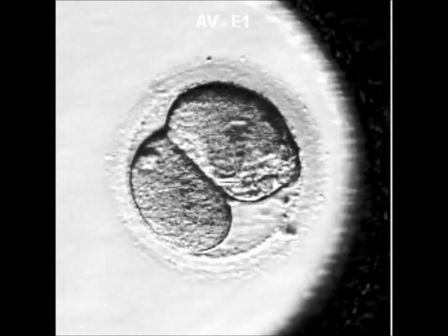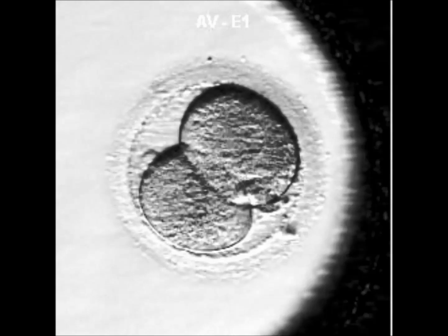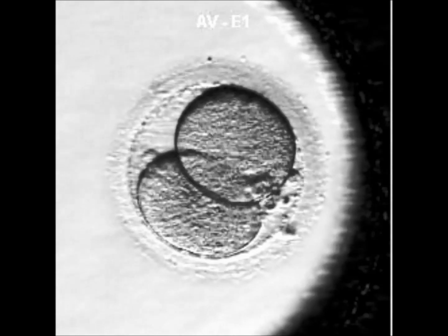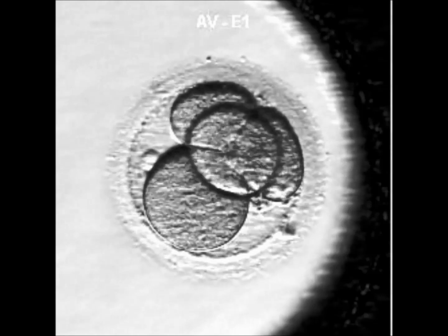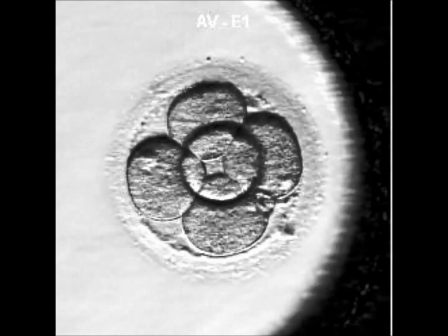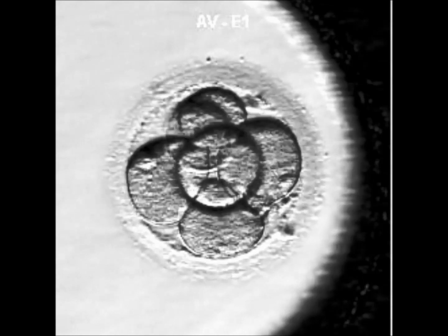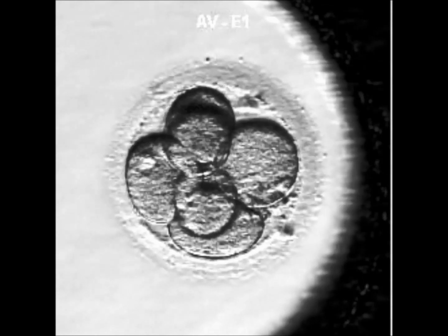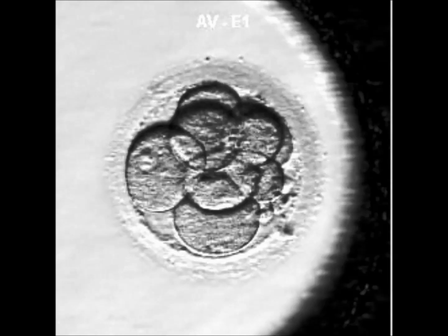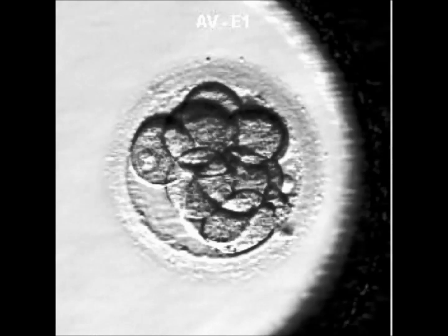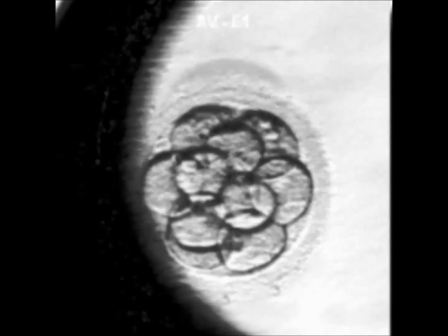This embryo divides normally into a two cell grade one embryo, but the right cell splits directly into three. Those three cells are abnormal. The left cell divides normally again into two, giving the appearance of a healthy five cell embryo when in reality it is mosaic, containing normal and abnormal cells. The rest of the division gives the appearance of a top grade embryo although in this case fails to reach the blastocyst stage.